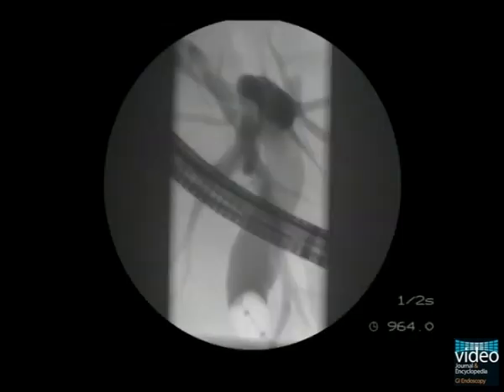At the end of the procedure, another occlusion cholangiography is performed. There are no remnant intraductal stones. Some air refluxed into the bile duct after the sphincterotomy may mimic stones in the cholangiogram; however, in this case, the dynamics of the air bubbles easily allows us to differentiate them from stones.